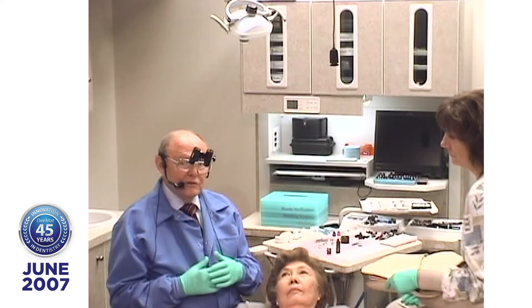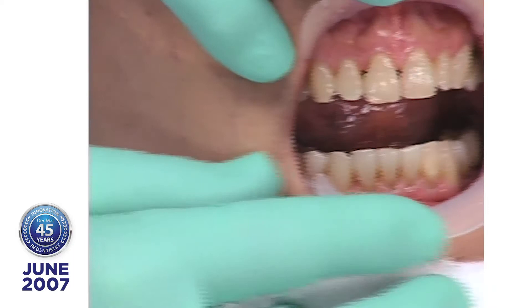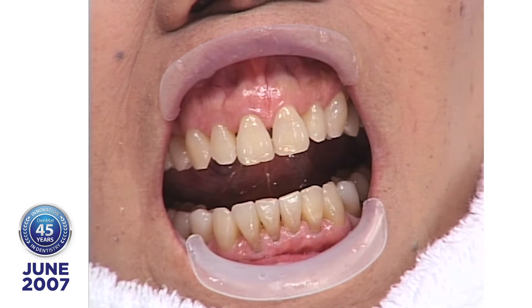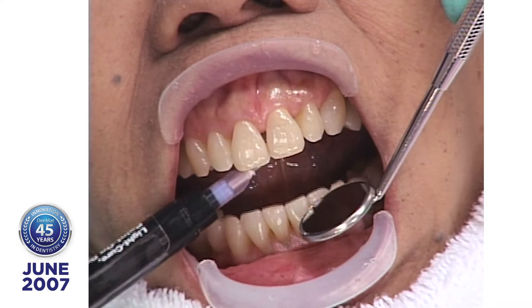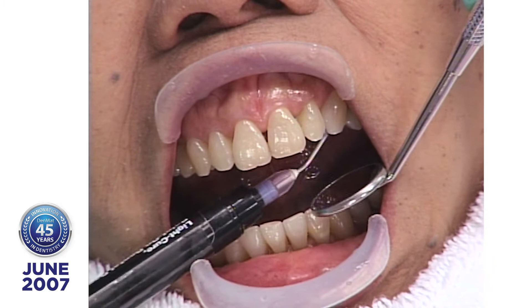Let's take a look at our teeth because they're really quite attractive. She's got a little erosion on that first bicuspid. We didn't remove a micron of tooth structure — could have done some cosmetic contouring, but in her case it wasn't necessary. I'm going to put paint-on Dental Dam on her lingual side and I'm going to be careful that it doesn't come through from the lingual to the labial, because if it does, it might prevent the lumineer from seating all the way.